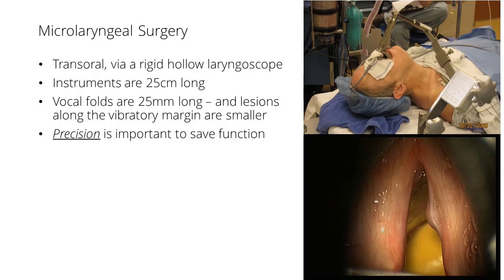What it looks like through an operating microscope that we put in place between us and the patient are these magnified views that allow us to look, for instance, at this cyst so that we can stretch the vocal fold and try to remove diseased tissue, and on the order of fractions of millimeters, try to save as much normal as we can. So this is clearly cold instrument surgery, done with an eye towards removing the cyst from within the right vocal fold. And these are most often benign lesions. We use these lasers for cancerous lesions as well, but the goal even with benign lesions is largely functional. It's trying to improve the quality of somebody's voice.